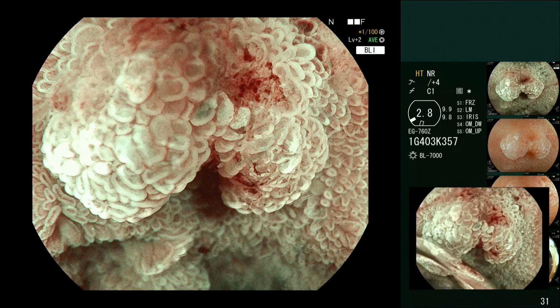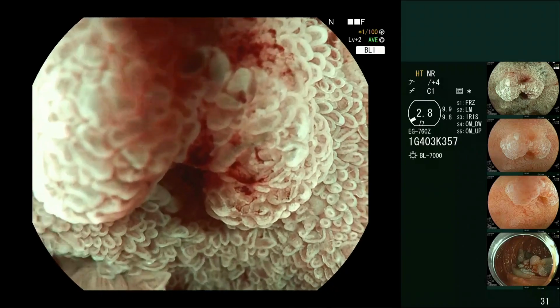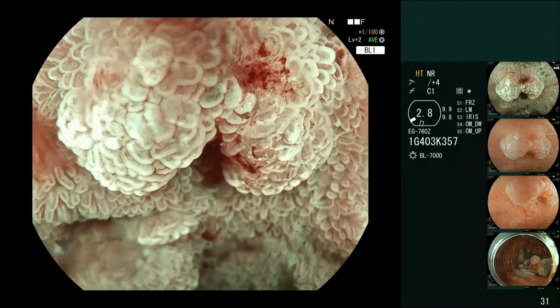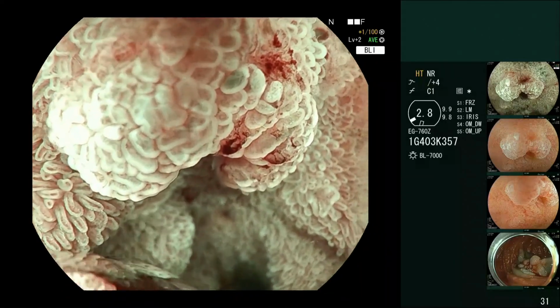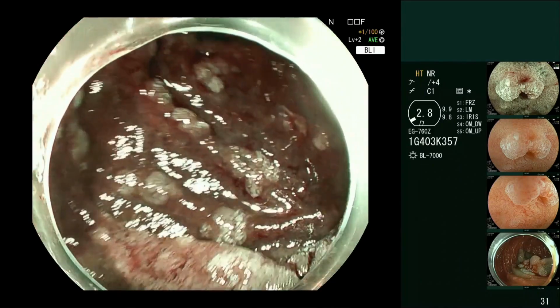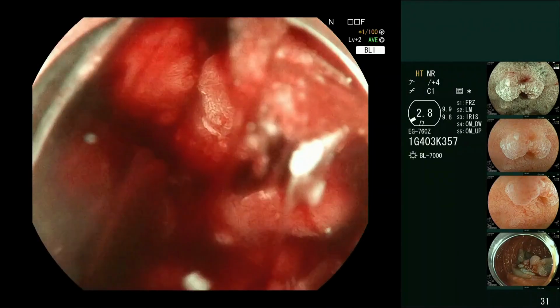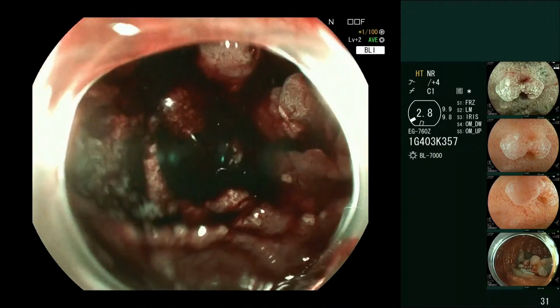The course of ampullomas and ampullary recurrence in FAP is very benign, and I think we're increasingly recognizing that. And the treatment is very invasive, particularly now to treat this recurrent disease here. So this needs to be properly discussed up front with the patients. What are the options? Of course, the options are endoscopic reattempt, surgical ampullectomy reattempt, and full-on surgery. Anyway, so that's how to look for that.